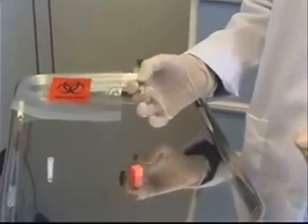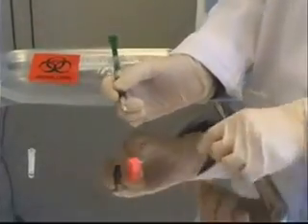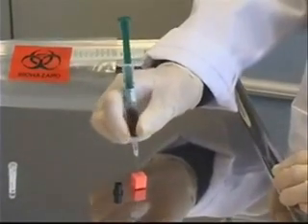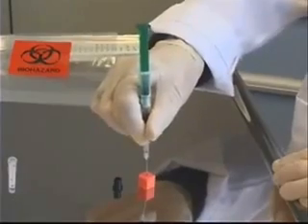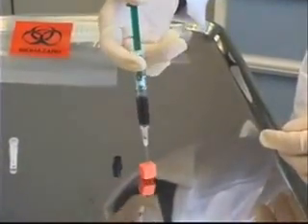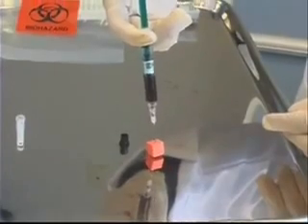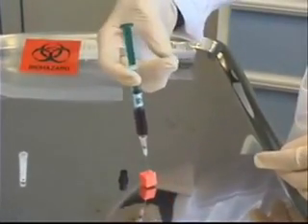While my patient is holding pressure over the site, I'm now going to take my needle and syringe over to my air cube and insert the needle straight up and down into the cube. I want to put it in far enough that the bevel is covered but not so far that it goes right through the cube. I then push down on the plunger to expel any extra air that might have gotten into the syringe, so it won't be left to affect the results.